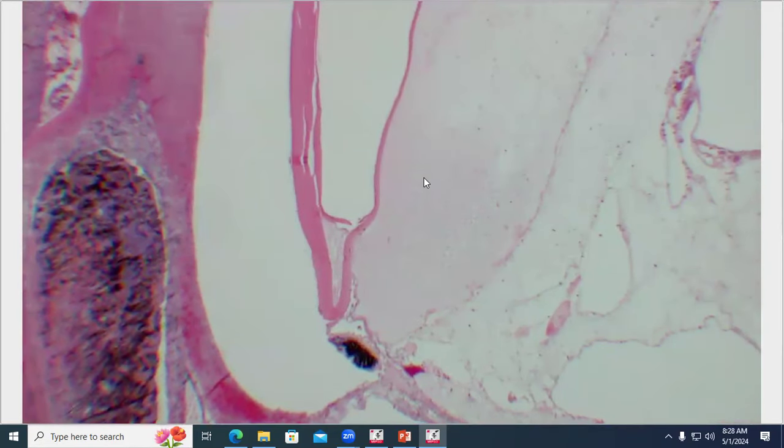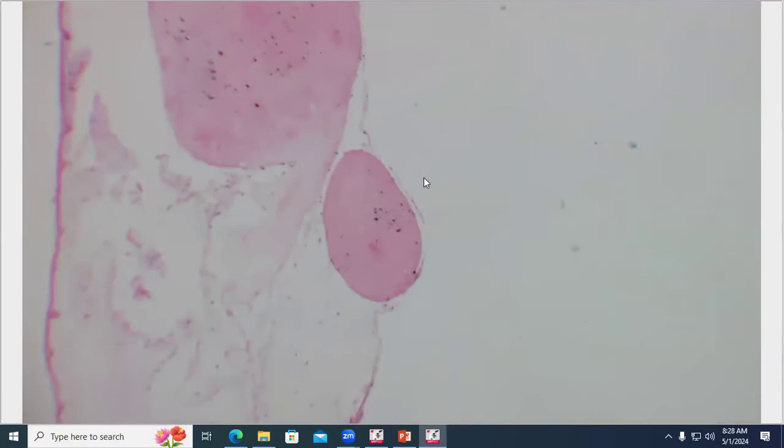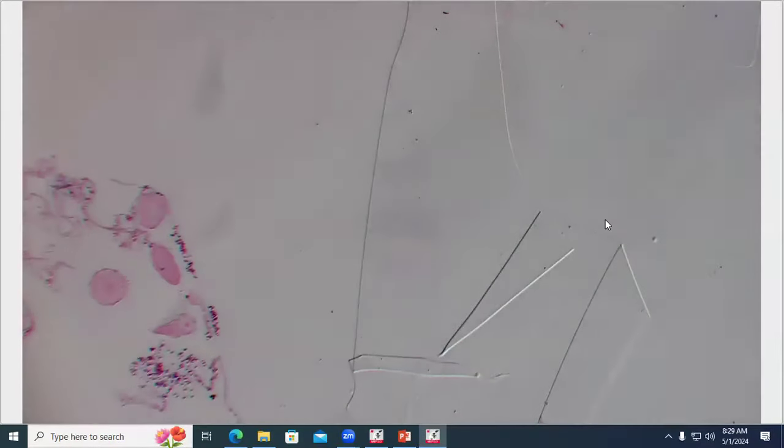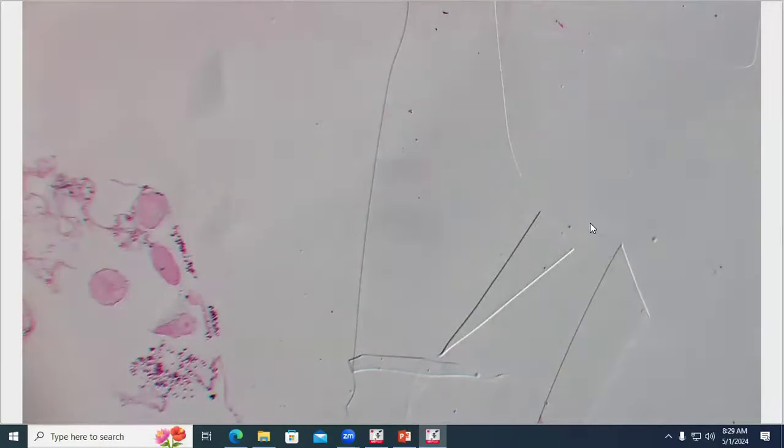lens was sitting. They're usually pretty easy to cut through grossly. And we don't always get them in section because they're sort of this faint outline here. And so this sort of folded material here, if I run my finger over the light source, it kind of highlights it. I digitally polarize it. Yes. So these angular shapes here are what's left from the intraocular lens that's folded over on itself from the cutting and processing. So that's always fun to see.